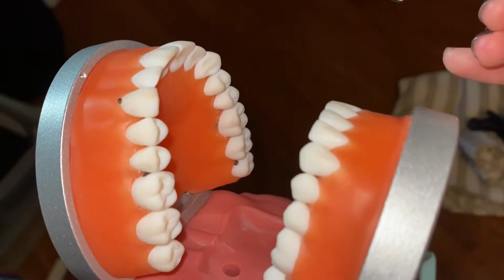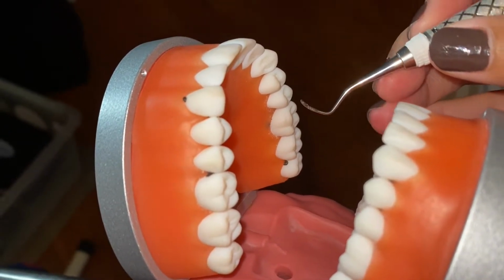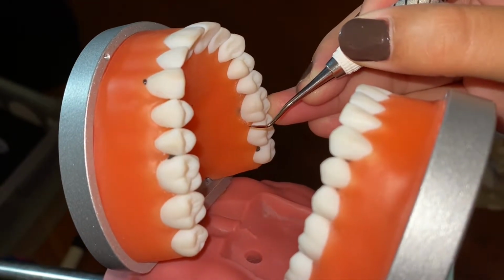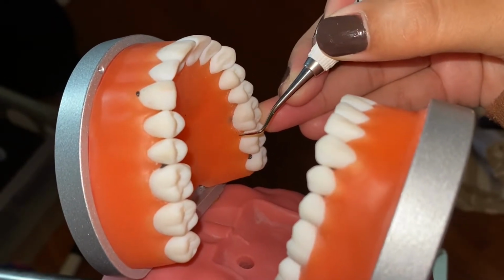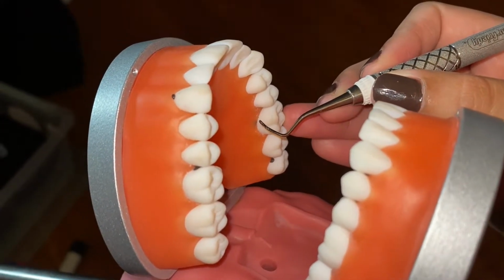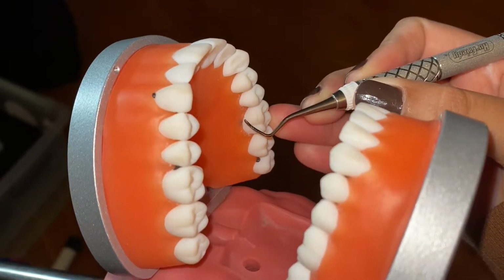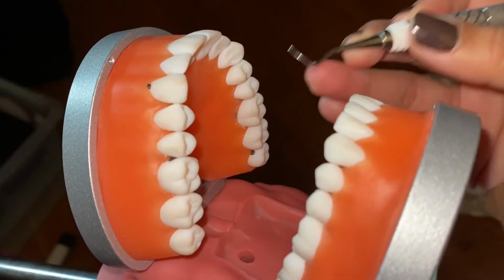We want to select the correct working end. There's a couple different ways. You can make it look like you're inserting the tip onto the distal surface of the tooth, and you can see that your terminal shank is parallel and your functional shank is up and over the tooth. The other way is if you are making the tip look like it's going towards the mesial, the face of the blade is facing towards the surface of the tooth that you are working on.